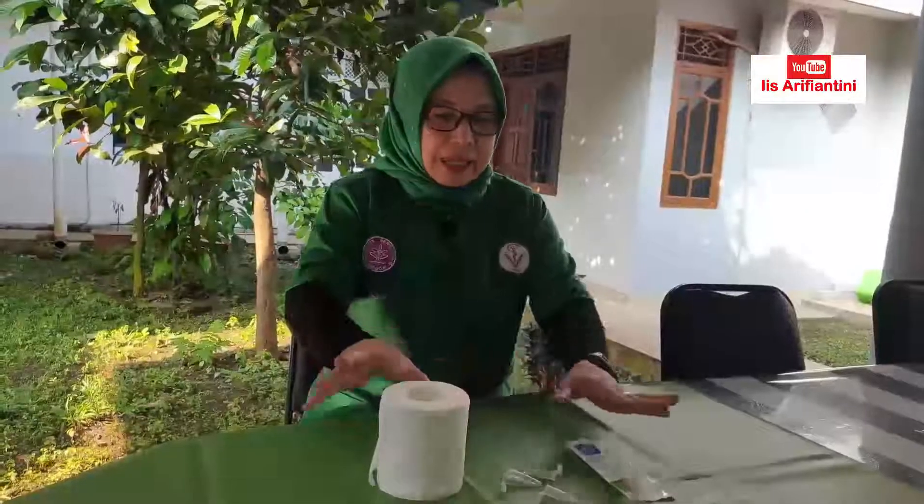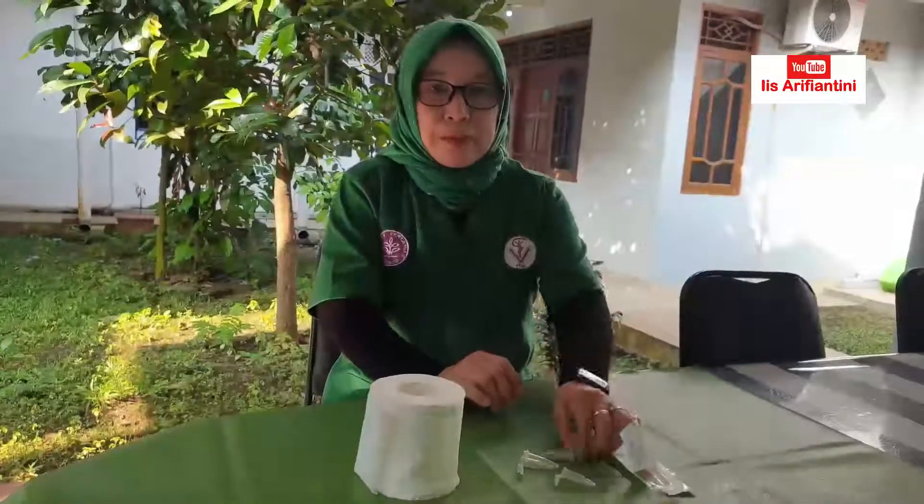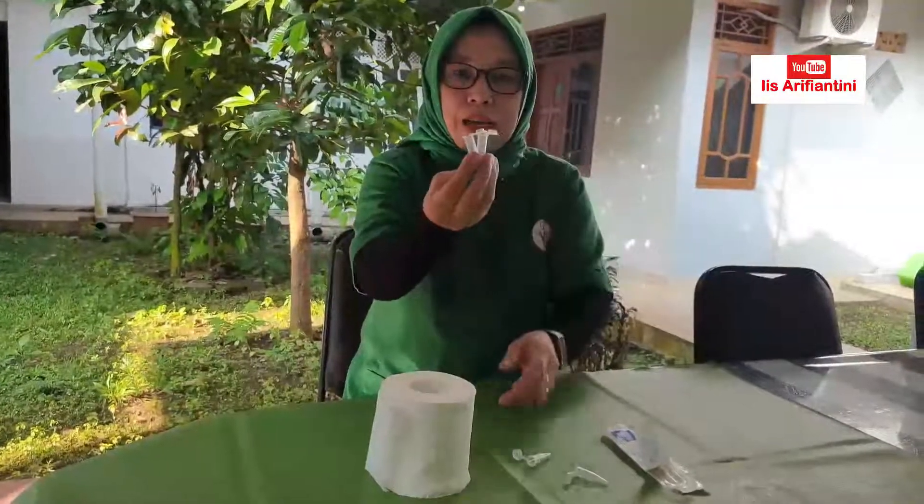Setelah melihat cara menampung semen pada ikan dengan cara stripping atau massage, mudah sekali kan? Sekarang kita akan melihat bagaimana cara menampung semen pada ayam. Alat penampungnya — ayam itu volumenya sedikit, hanya 0,3 sampai maksimal 1 mililiter, jarang sekali — biasanya 0,3 sampai 0,5. Tabung penampungnya bisa menggunakan tabung mikrotube ukuran 1,5 mililiter.